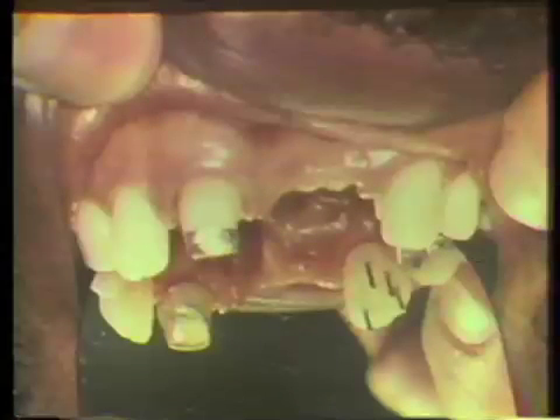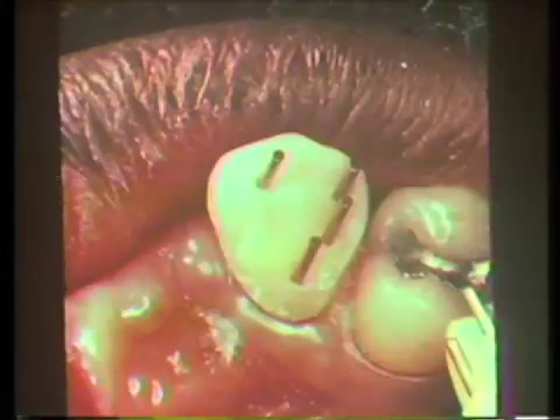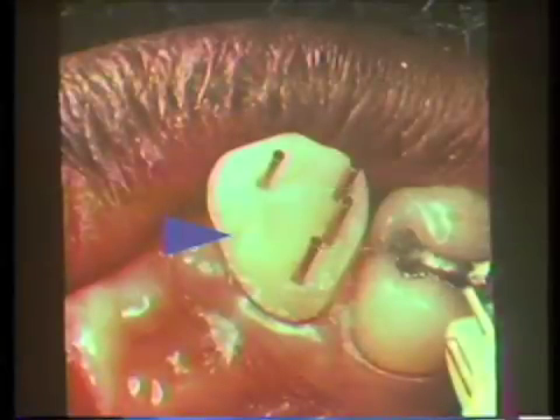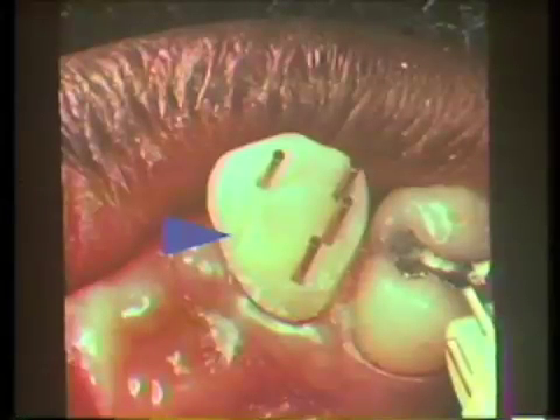The Duralay pattern has been cast and it has been cemented in the tooth with zinc phosphate cement. The preparation has been further refined so that there's a millimeter and a half reduction on the labial surface and a half millimeter reduction on the lingual. There's also a two and a half millimeter reduction on the incisal edge. The pin ledge preparation has also been prepared on the cuspid, and you'll note that the pin ledge preparation has four pins — this gives added retention for a longer span bridge. The two incisal pins are three millimeters in depth and the cingulum pin and the marginal ridge pin are two and a half millimeters in depth. A groove has also been placed on the mesial slice, which gives rigidity to this slice area and the area where a solder joint will be placed.